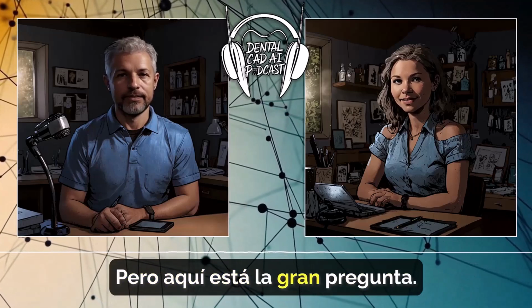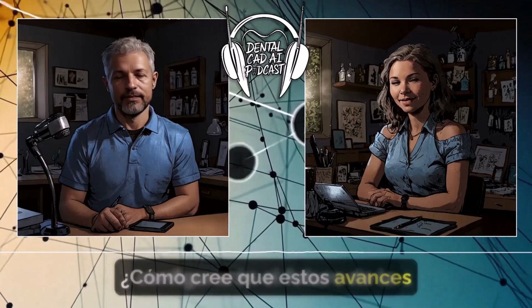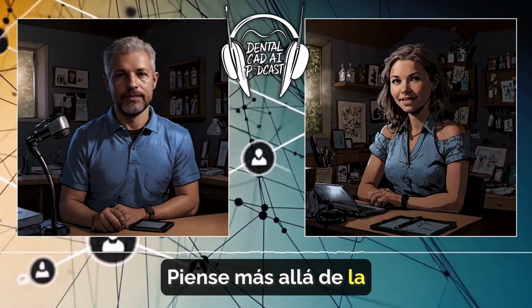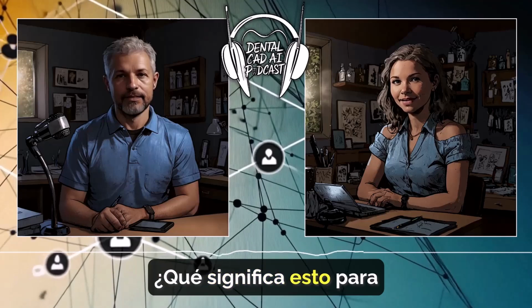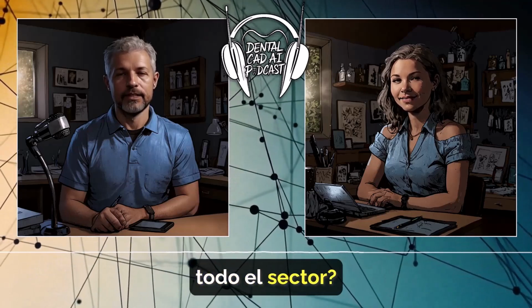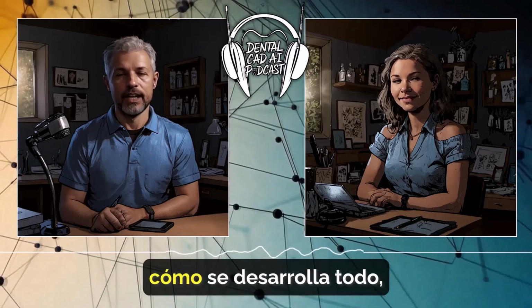But here's the big question. How do you think these advancements will shape the future of dental care? Think beyond the technology itself. What does it mean for patients, for dentists, for the entire industry? That's a great question to ponder. Yeah, I think it'll be interesting to see how it all unfolds.